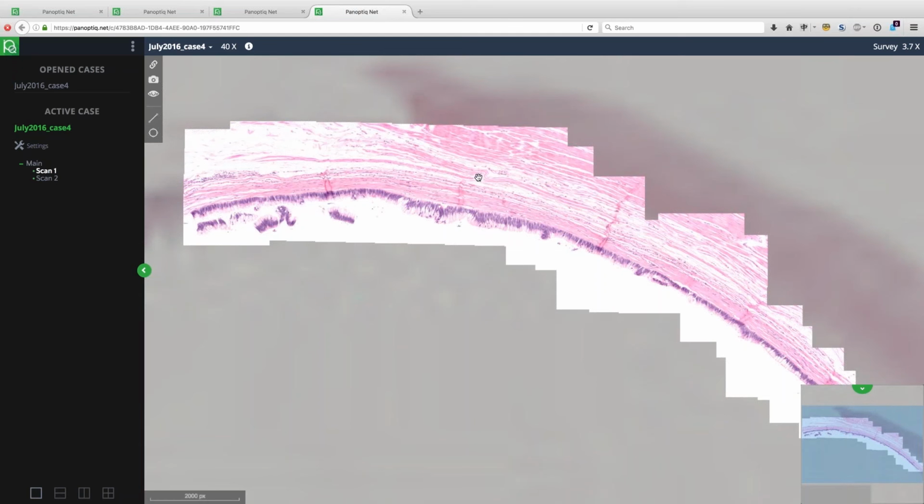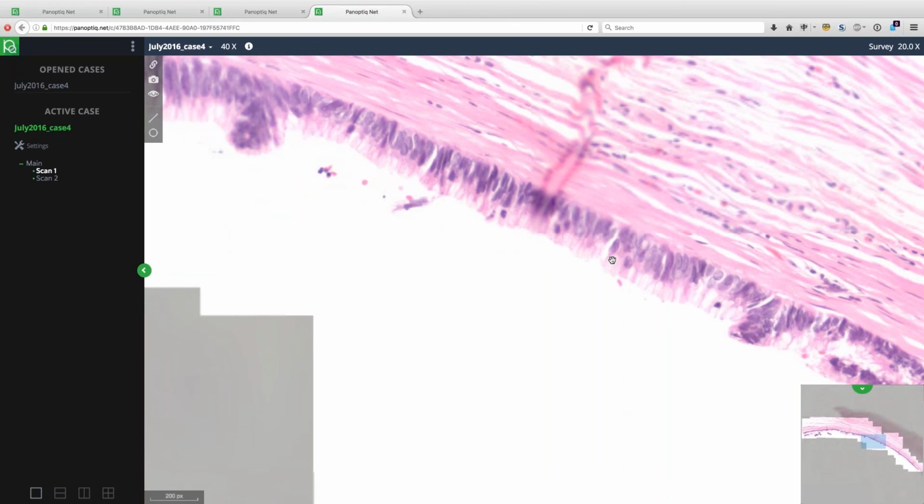Excellent. So there is a little bit of proliferation. The nuclei are a little bit larger, more elongated, more pseudostratified, and they have all the morphologic features of a very classic benign mucinous cystadenoma of the appendix. Again, not a very uncommon lesion, but exceedingly challenging to take still images of and project them on tumor boards. So excellent. Let's go to case 3.